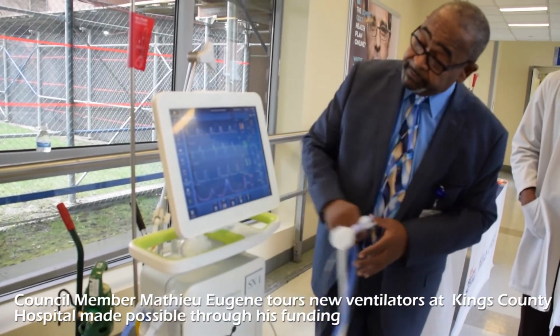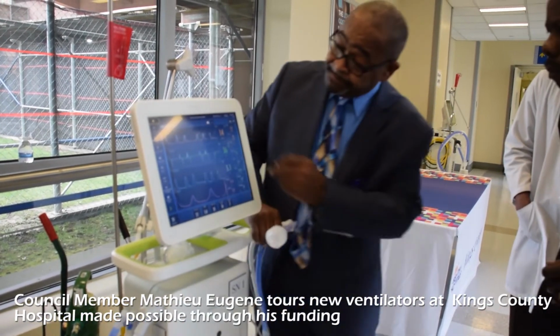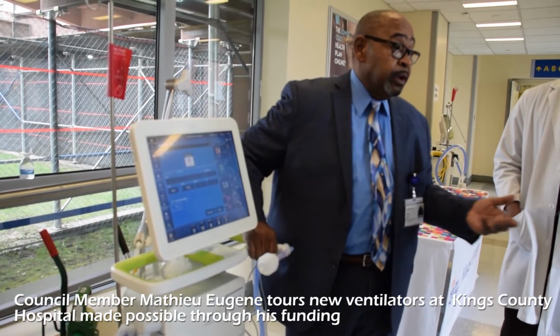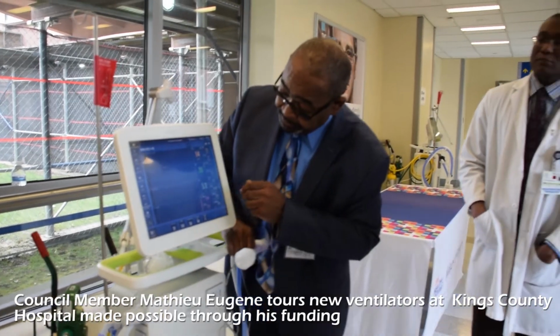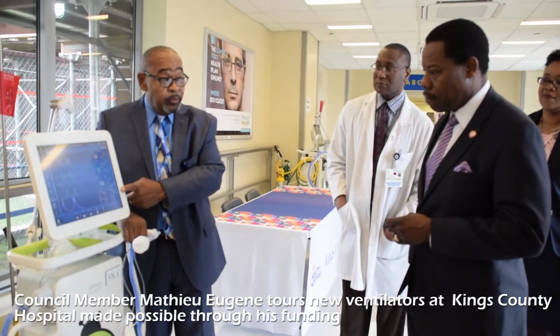The other thing that's nice, if you look here where it says PBW, we can actually put in the baby's predicted body weight. And for a baby, their birth weight and predicted body weight are one and the same. So we put that in, and what that does is we can look here and see how many mLs per kg we're giving the baby.